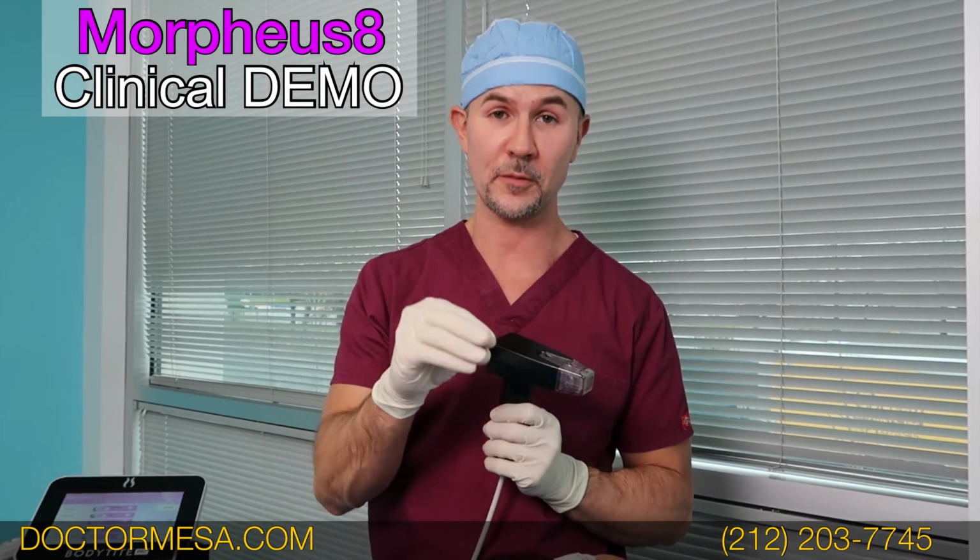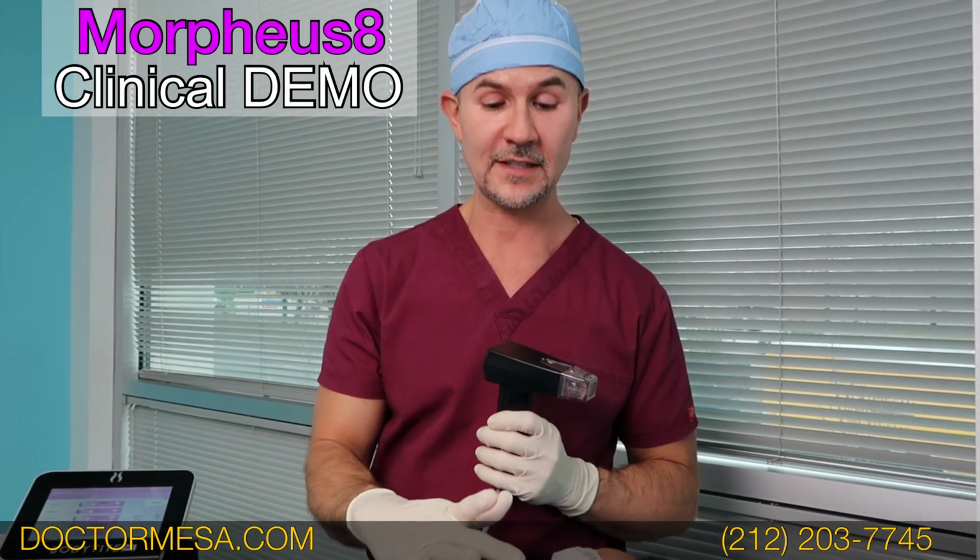Okay, so I hope you like this video. This is the explanation of how the Morpheus8 is used to reshape the face and the body. In this case, the face, when it's used in the body mode, that is 4 millimeters deep, the needles go to 4 millimeters deep, it produces reshaping of the excess of adipose tissue in the face, in this case, and then there's a little lift of smile lines and the lower face. And when it's used in the face mode, it produces a Fractora mode, so it produces skin tightening.